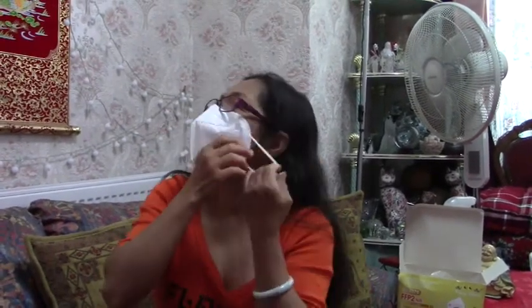Yeah, a bit better. So that's what you do, guys. This is the technique. If it's too big for your face, then twist it like that, and then do like that. Okay, so it's a bit tighter now. Still open on this side. How about like that? So, twist, pinch it a bit, and then like that. So at least it's closed.